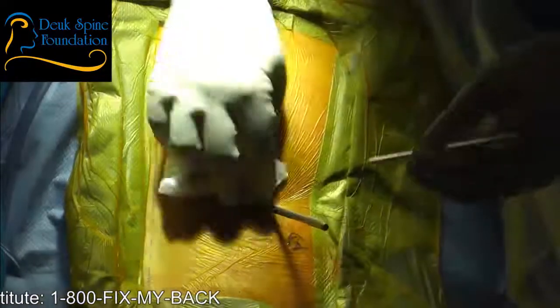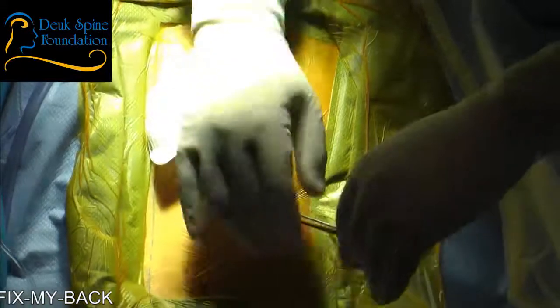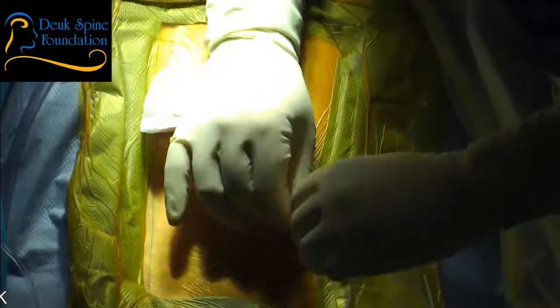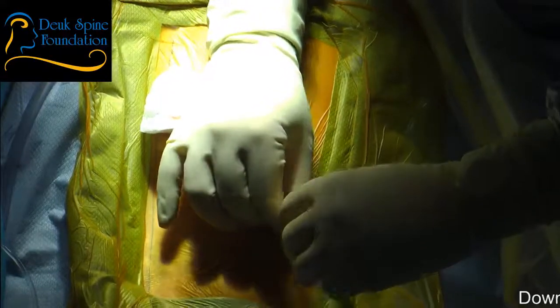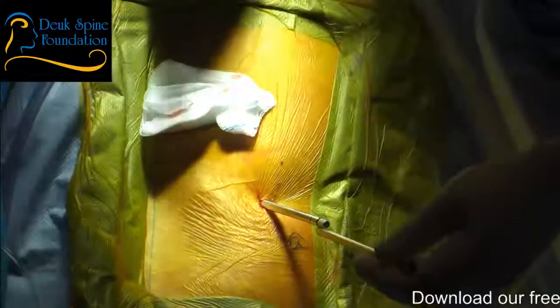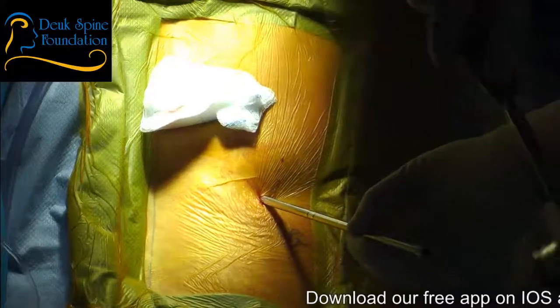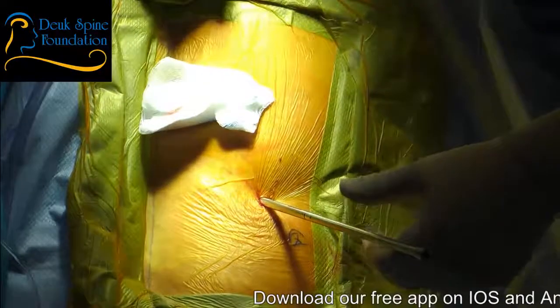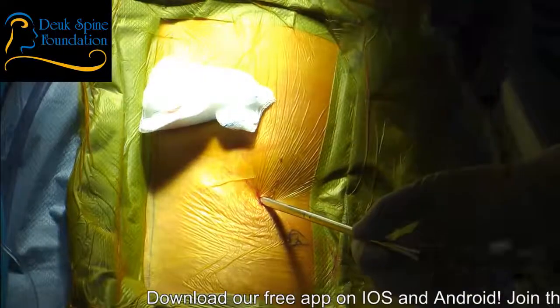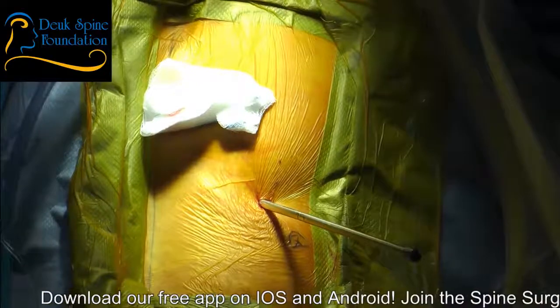And we just confirmed placement with an AP lateral fluoro. So I'm very happy with our positioning. We're inside the disc now, which is the safe place to be. I just didn't start like that. And that is not a technique for beginners. Trust me, it's a very advanced technique. I do not recommend any beginners do that. You should have at least a minimum of 100 cases under your belt before you do something like that. I didn't start doing it until I had well into the hundreds.